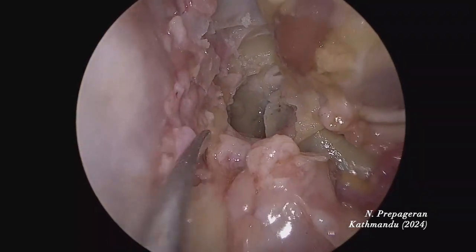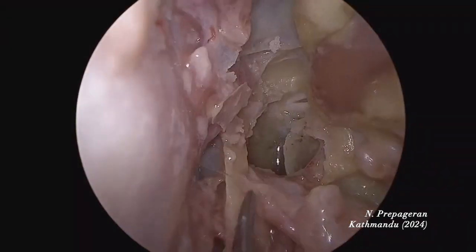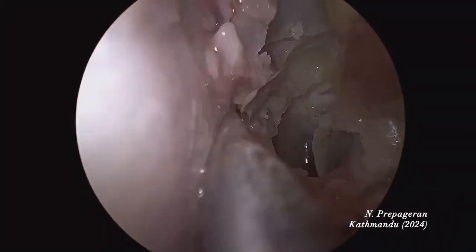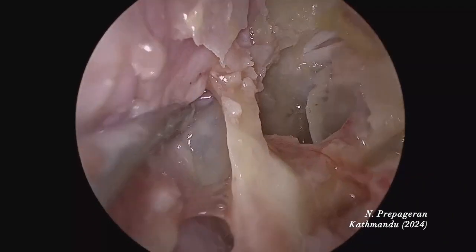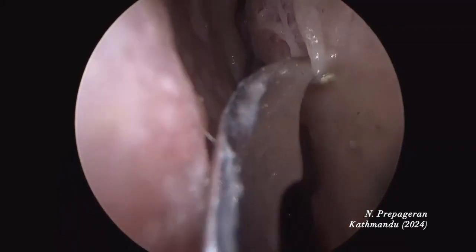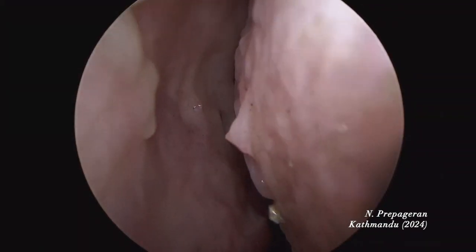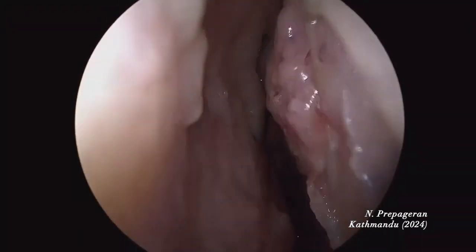I'm going to dissect and expose the sphenoid keel on both sides. Here is the sphenoid keel on the right side that's been exposed. I'll do the same on the opposite side — that's the opening of the sphenoid ostium. I'm going to cut across and raise another septal flap with the elevator. Now you have a double septal flap for reconstruction.